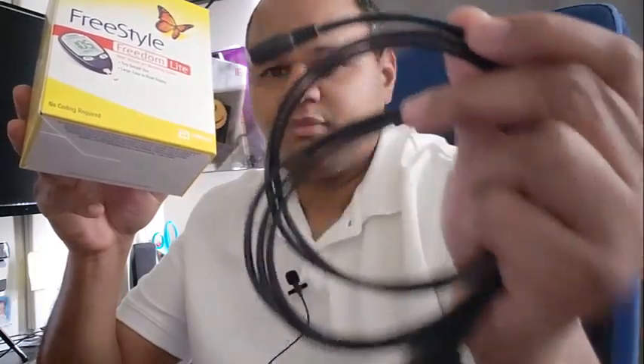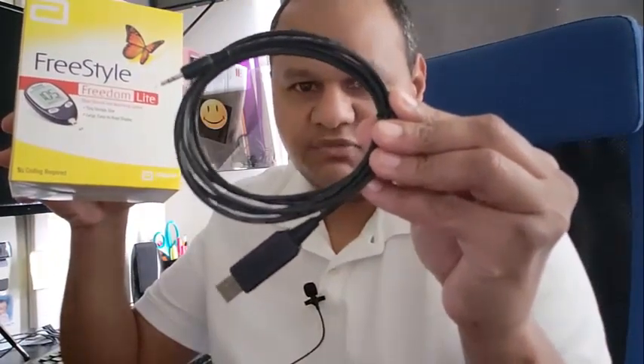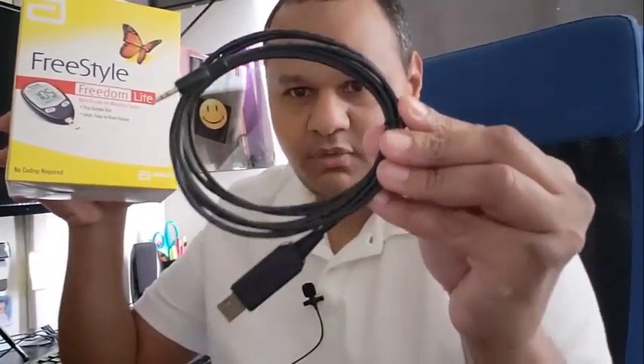I will be showing you guys how to download the software and the necessary drivers to make this meter work with this Freestyle USB cable. We will be downloading the software from online. Let me quickly open this meter up in front of you guys so you can see that it is a real meter — I purchased it from Amazon along with the cable.